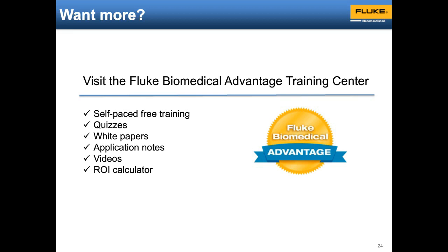Great. And if my tester doesn't have the R curve for my device, can I just test using a different R curve? No, you probably shouldn't do that. Most of the manufacturers have to do a very specific R curve around the sensor and the firmware that they've written around that.